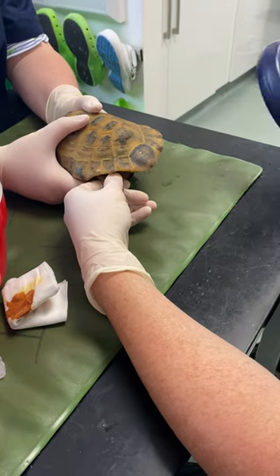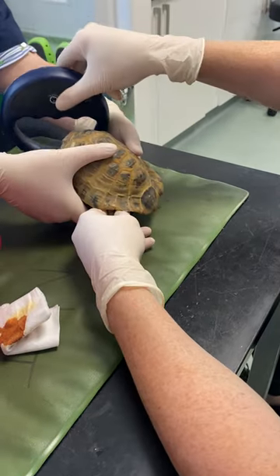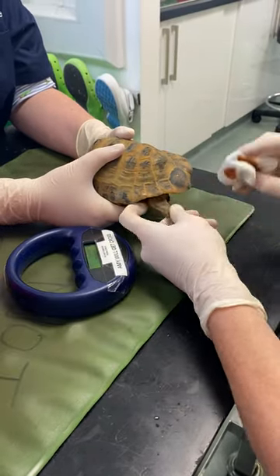Today we're going to show you how to microchip a tortoise. We're going to check all four legs to make sure there aren't any existing microchips, but the main location — the only place we should be putting a microchip — is the left hind leg.